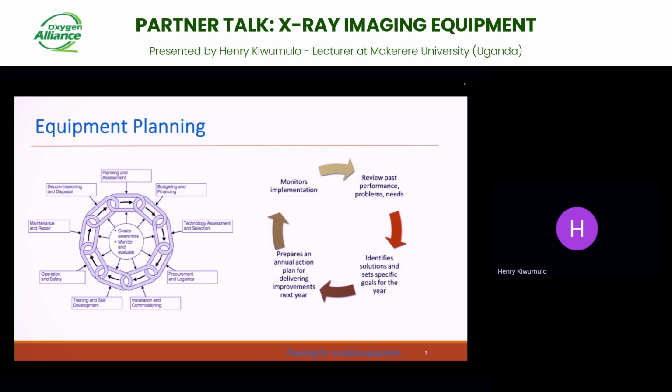X-ray machines are quite vital, and they sometimes involve hazardous conditions. One requires a plan, and this planning has to be oriented to the X-ray type that you hope to get, and even its after effects after obtaining it.